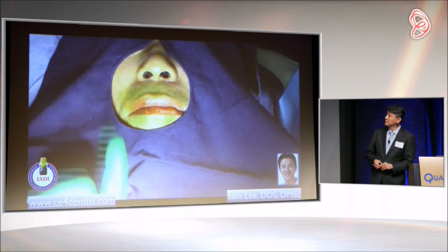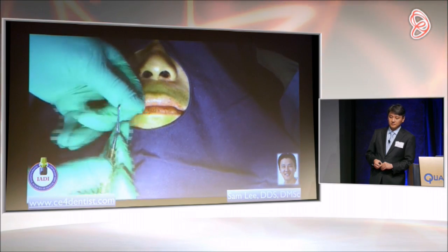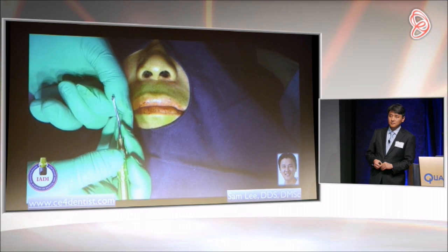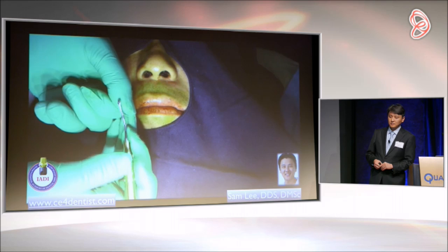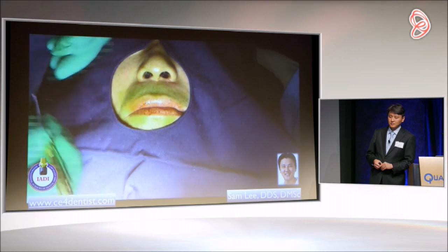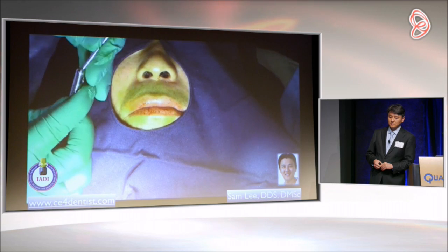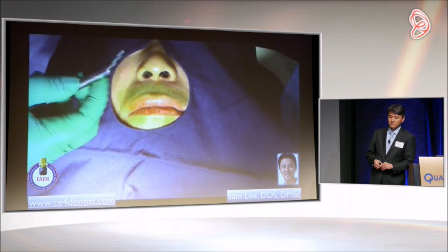And afterwards, it's impossible to do decortication to accept bone. So we made this special curette where you can go inside the tunnel to curette all the periosteum. And by doing this, you prepare your site so that it can accept the recipient bone. And then we have this blade where you can change the angulation of the blade. Give me the 15 blade.